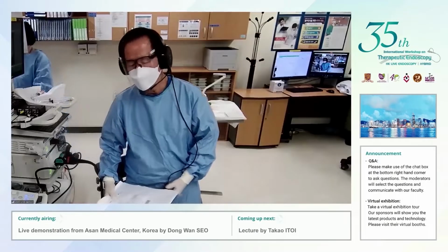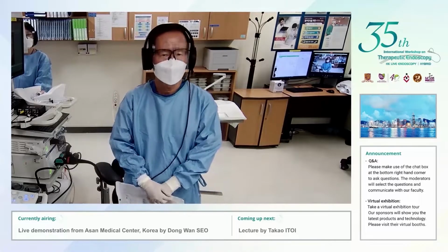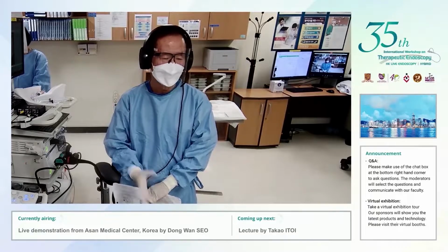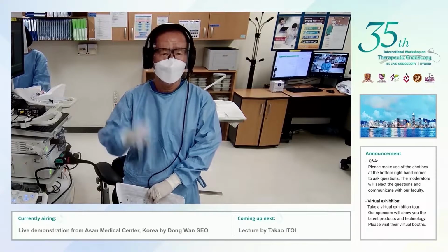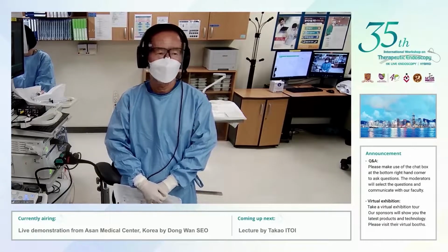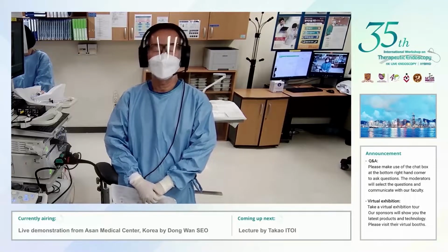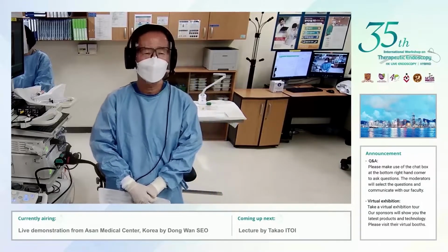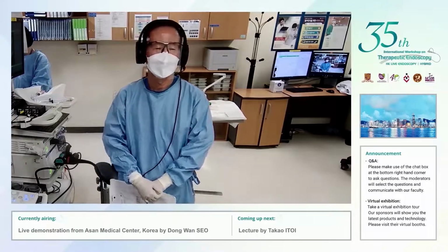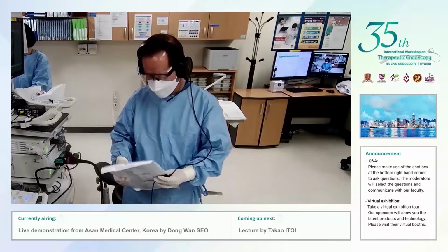Yes, we prepared one case of pancreatic cyst. So I will do EUS examination of the cyst. Firstly, we will check the morphology of the cyst and try to differentiate the pancreatic cystic lesion morphologically. Secondly, I will try to aspirate the cystic fluid for biochemical study, CEA, amylase, or sometimes cytology, those kinds of things. And nowadays we are also trying to analyze glucose. And finally, we are going to use Moray forceps biopsy to get the histologic diagnosis.